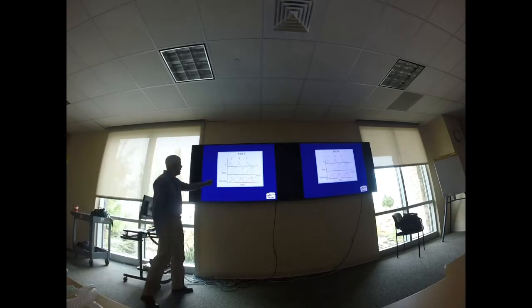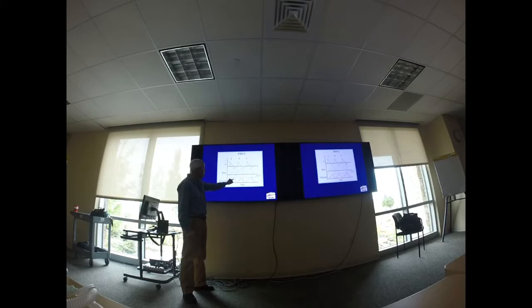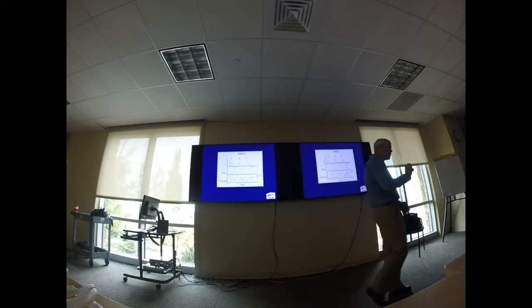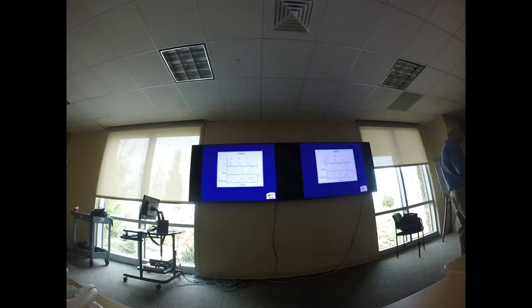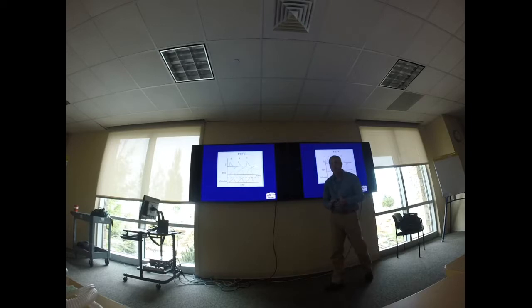So this is a graphic representation of pressure regulated volume control, and you can see you got your pressure and your volume right here, and so it's maxing out to a pressure, but it's only delivering the volume that it can at that point, right? So what I'm going to do in a pressure regulated volume control is I'm going to set my pressure, I'm going to set my volume, and hopefully I'm able to obtain both.